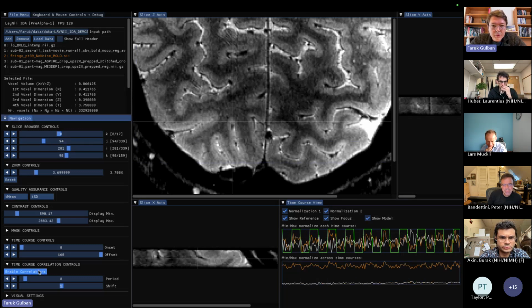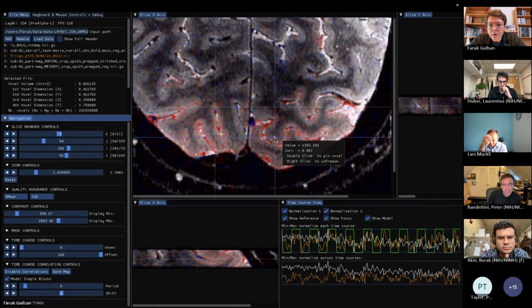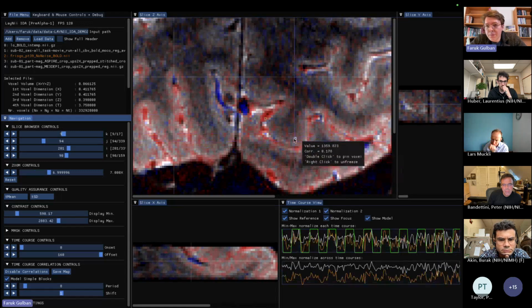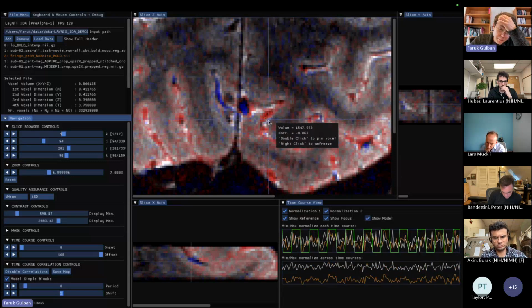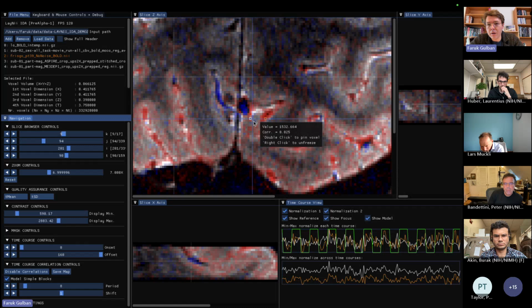Yes, and so now if I enable a simple model, let's have a look. This is just a ones and zeros model to see some activity. So what do you see in this 0.4 millimeter fMRI data? Red is basically a correlation, and I do not normalize it in some weird way. If it is red, it is 1. If it is blue, it is -1.